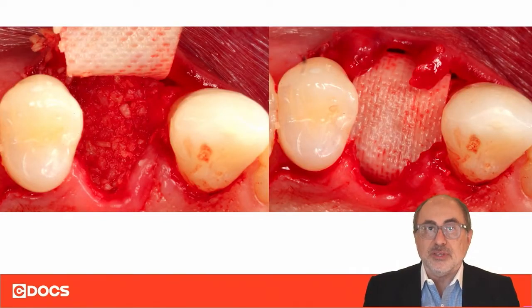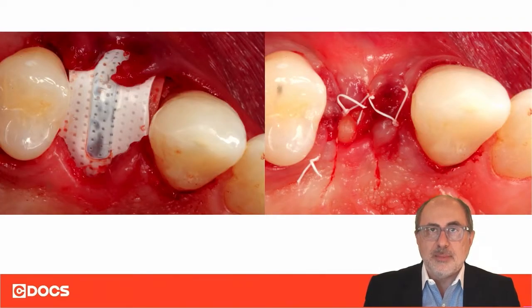In these type of cases, what I like to do is use a double membrane technique. You can see here, we have packed the bone into the socket area, reconstructing that entire area. We then first place a long-acting resorbable membrane — in this case, this is an Os6 Plus membrane — that we place as the first layer.